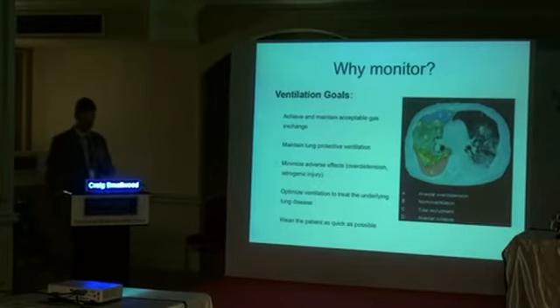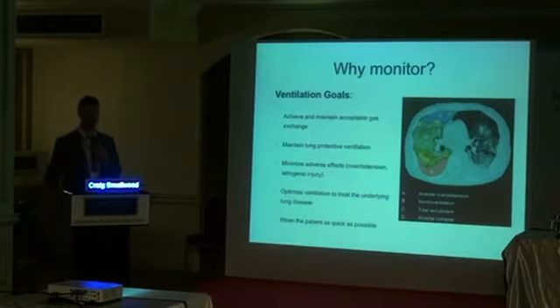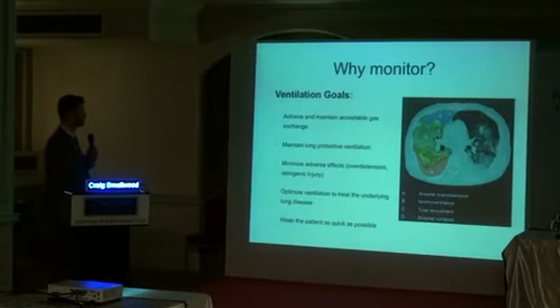We have a lot of important ventilation goals, and a few of the key ones are to achieve and maintain acceptable gas exchange, obviously PaO2 and PaCO2 in our patients. We want to maintain lung protective ventilation. Principally, we do that by gross metrics of lung inflation, but we maintain with positive end expiratory pressure and small tidal volumes or titrated to the specific disease of our subject.